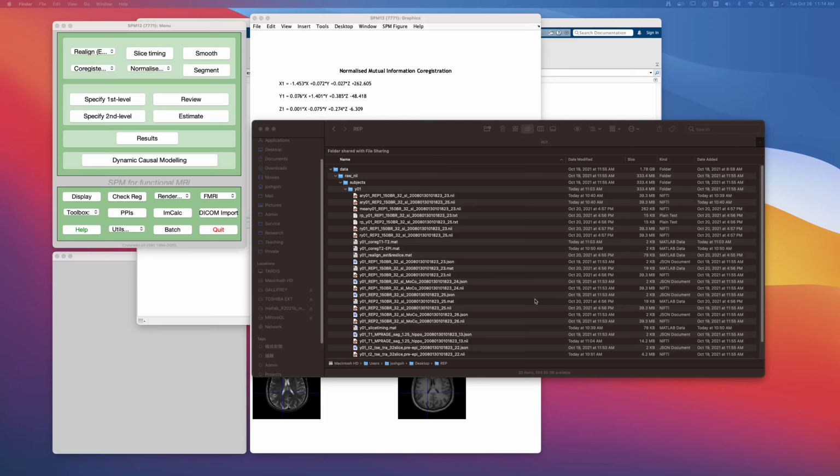All right, this is difficult because everyone's brains have different size and different shapes. It wasn't an issue when we were working with just the single subject. We could just apply rigid body transformations, XYZ translation and XYZ rotation. But when it comes to moving or deforming or reshaping a given subject's brain to a common template or a common map, we can't use the rigid body assumption.